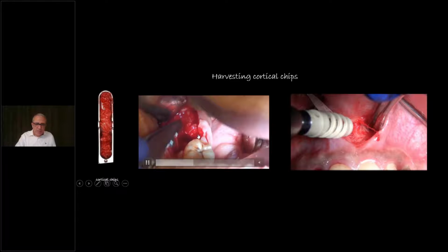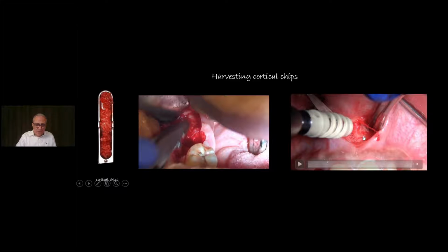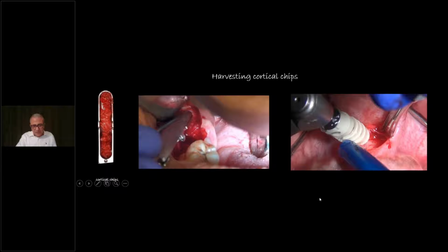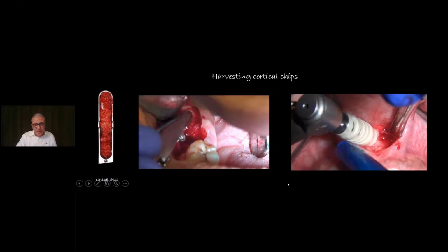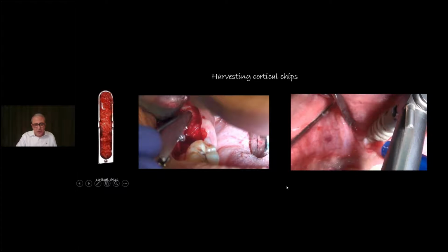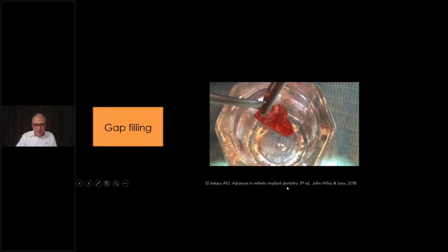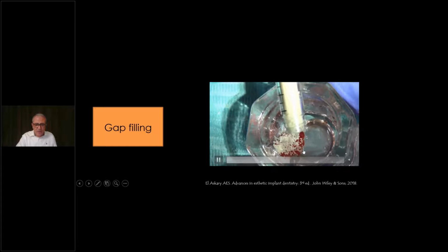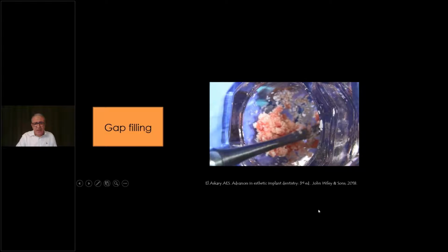I just go to any place to harvest the chips, or even the nasal spine. The chips are really important in order to maintain your osteogenic graft capacity. And here is what we do. Simply, we put the 75% chips along with the deproteinized bovine bone. This is what I use all the time, and I fill the socket with it.